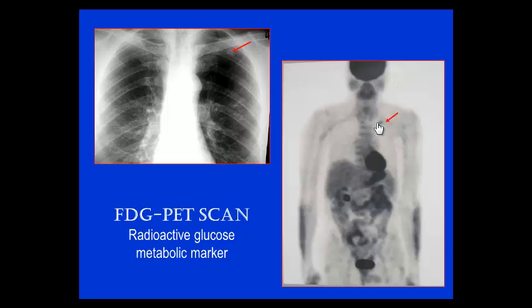It might be hard to tell, but from knowing there's a nodule in the lungs right there, we can tell that excess metabolism at that nodule can be a pretty worrisome finding that might be a malignancy, because see, that's got much higher metabolism than the remainder of the lung, and malignancies certainly can have higher turnover with all that growth going on there. PET stands for positron emission tomography, but it's a radioactive glucose scan which shows you something of metabolic activity, and that metabolic activity can be somewhat of a surrogate for a predictor of malignancy.